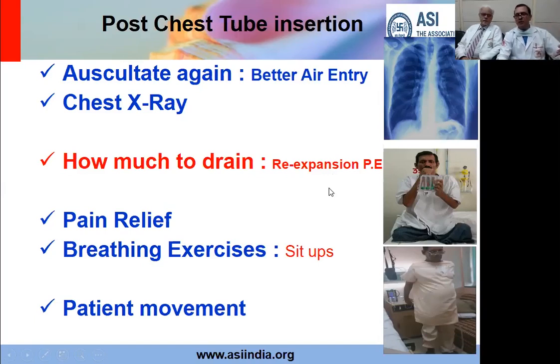So if you have a massive effusion and the lung has been collapsed for a long time, it's important that you initially drain about a liter, then clamp it for a few hours, drain another 500, 600, 800 cc after 4 to 6 hours, clamp it again, and do it in aliquots of about 500, 600 to 700 cc at a time. And slowly, also keeping a watch on the hemodynamics of the patient, because sometimes sudden drainage of a large amount of fluid, especially in a hypovolemic patient, can actually lead to hypotension also.